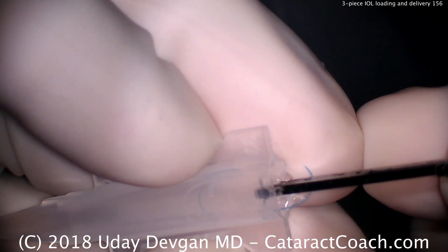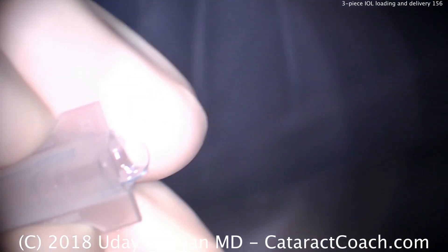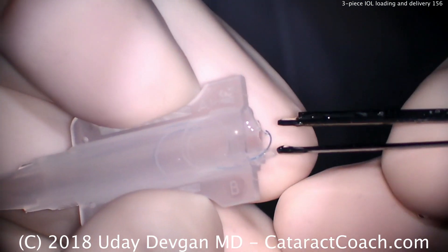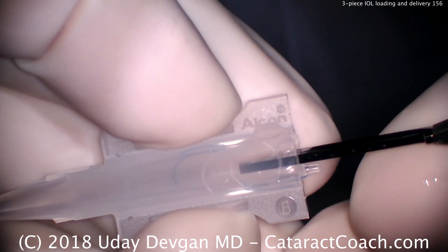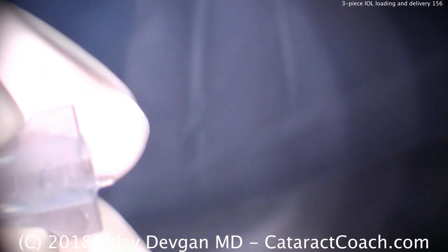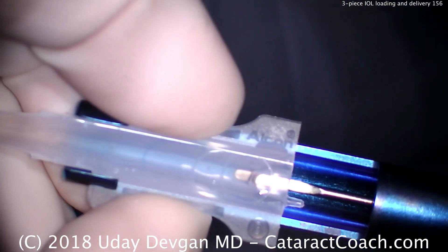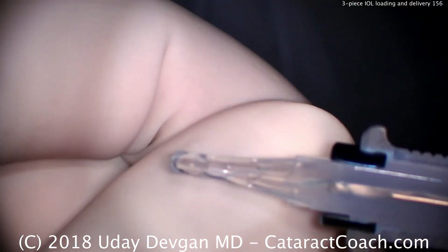There we go, just seating it appropriately. What's going to happen — and we'll do everything correctly — is that the leading haptic will twist as it goes down the plunger. Watch. When it goes down the tip of this injector, being pushed by the plunger, that leading haptic will twist in the incorrect orientation. Slowly advance the plunger; it goes down the barrel to the final tip, and look at that — the leading haptic has flipped the opposite direction that we want.